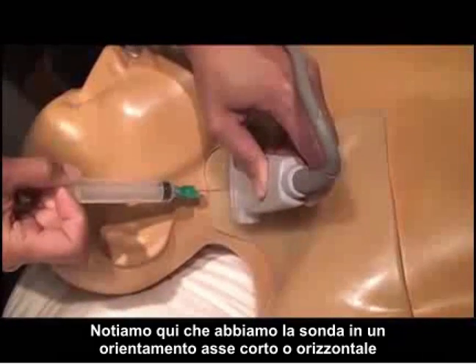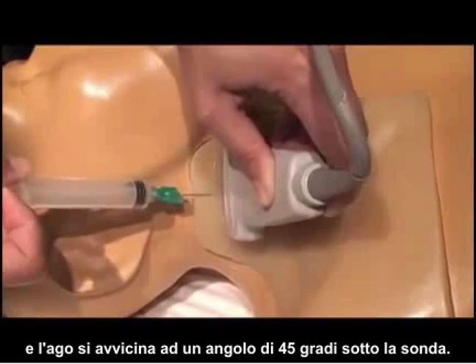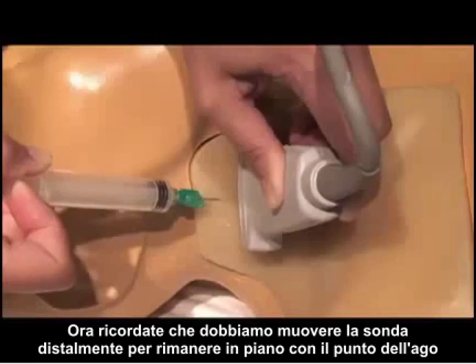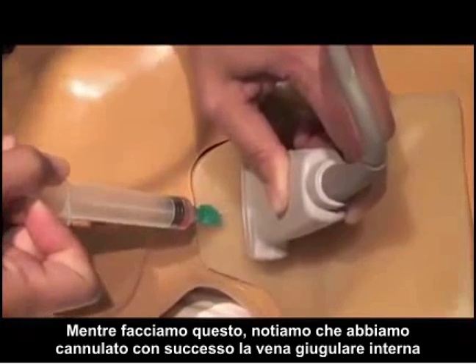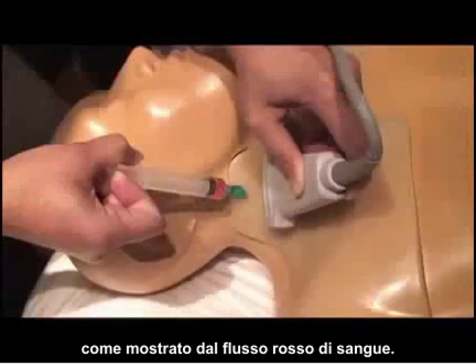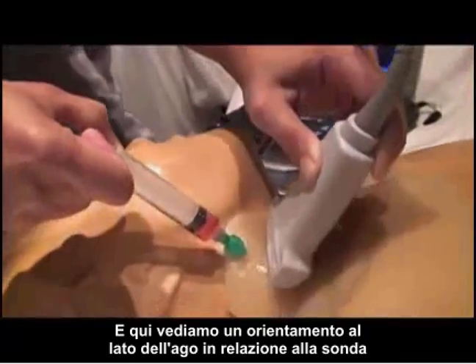Notice here we have the probe in a side-to-side or short axis orientation and the needle coming in at a 45-degree angle underneath the probe. Remember that we must move the probe distally to stay in plane with the needle tip as we advance it underneath the skin and into the internal jugular vein. And as we do that, we notice that we've successfully cannulated the internal jugular vein as shown by the red flow of blood. Here we see a side orientation of the needle with regard to the probe.